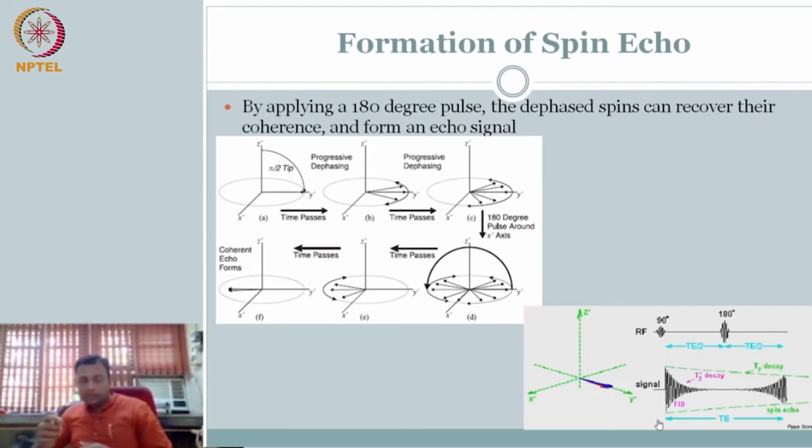The pulse sequence can be manipulated to get whatever aspects or characteristics of the material property you want. Namely here, at least in this limited discussion, we have three characteristics: proton density, T1, and T2 of the material. We can exploit, understand, characterize, and measure them using your sequence of application of the excitation pulse, and of course the timing involved when you are recording, after how long you are applying. All these are parameters of acquisition.